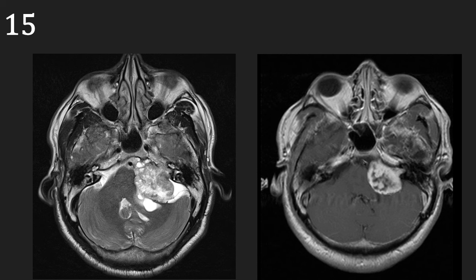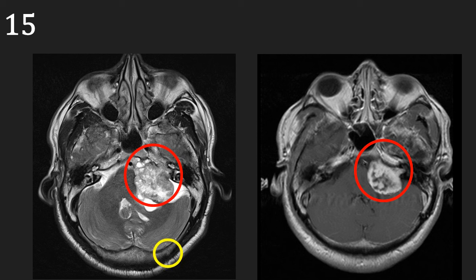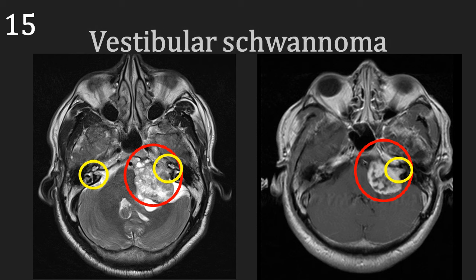Our next two cases are also of mass lesions; however, the history and anatomy will help us narrow down the diagnosis even further. Here is a 44-year-old male patient who presented with left-sided sensorineural hearing loss. We can easily appreciate the large irregular mass lesion compressing the brainstem and the cerebellum on the left-hand side. What will help us is identifying the key structures adjacent to it and where we would expect the normal structures to be. Here are the cochlear and semicircular canals, highlighted in yellow. On the right-hand side, we can easily appreciate the vestibulocochlear and facial nerves. However, on the left-hand side where the mass exists, we cannot see the nerves. This leads us to the diagnosis of vestibular schwannoma.